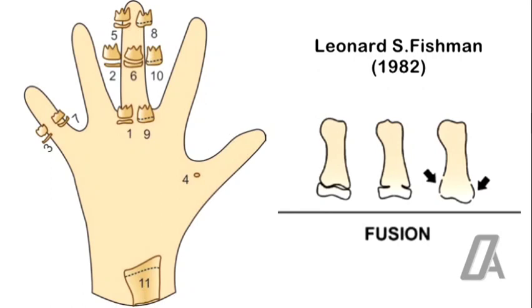At last, there is fusion of epiphysis and diaphysis in the distal, proximal, and middle phalanx of third finger, and also the radius.